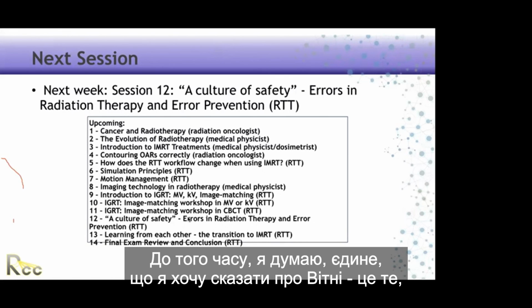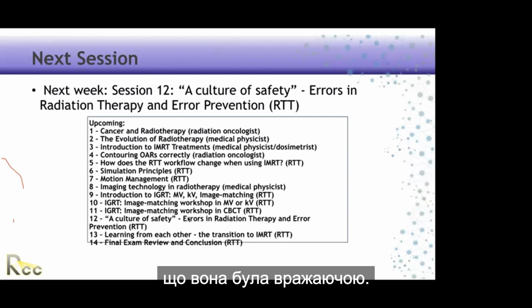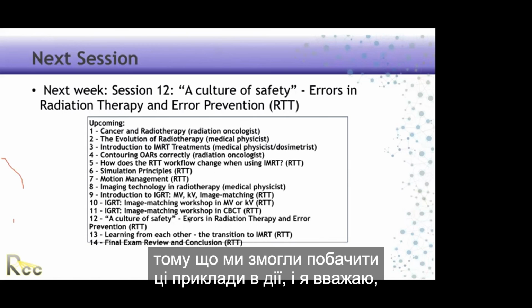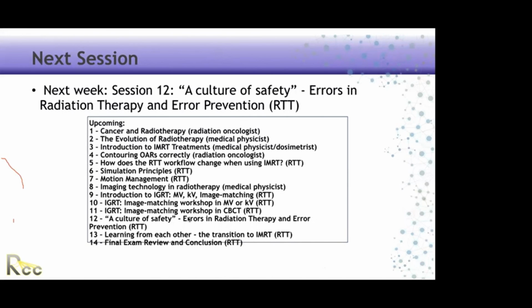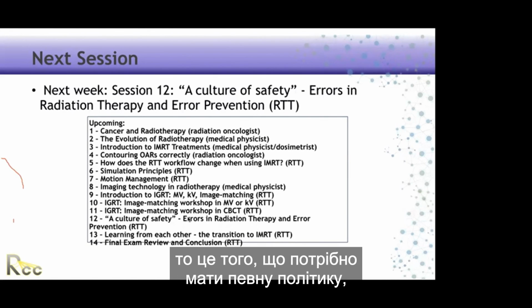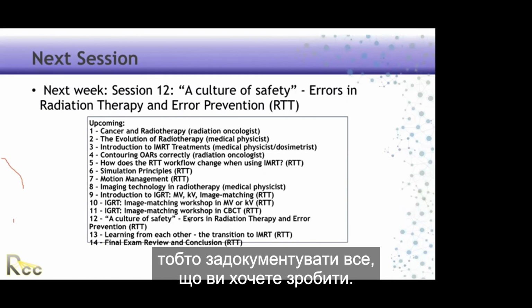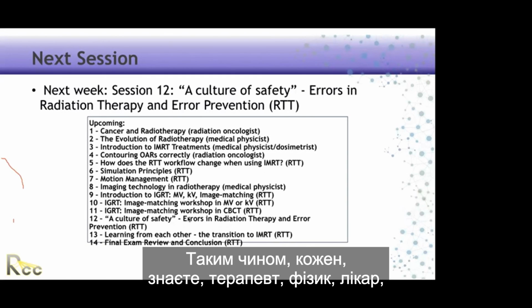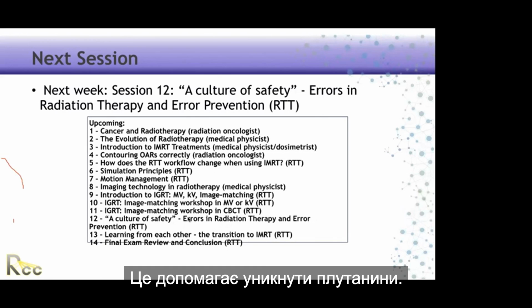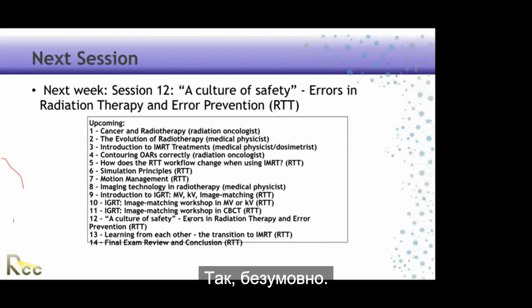Until then, one thing I want to say, Whitney, is that was awesome. Thank you for those overviews. I think the videos especially were great, to be able to see those examples in action was a very nice touch. And I think your takeaway point of having some sort of a policy is important. If I've learned anything in this field, it's that having everything documented of what you want to do, so that everyone, therapist, physicist, doctor, all know the expectations and what the tolerances are, helps avoid confusion. Yeah, definitely.